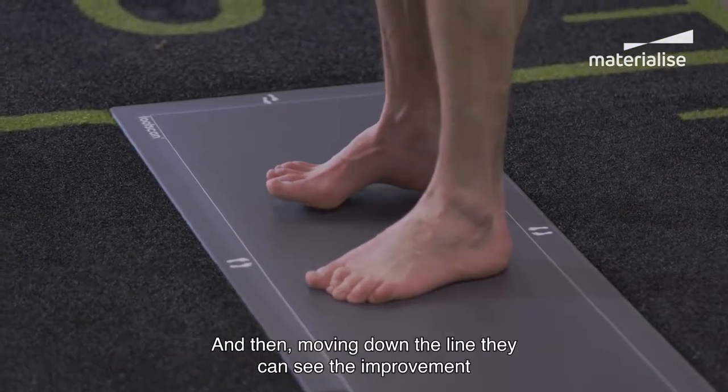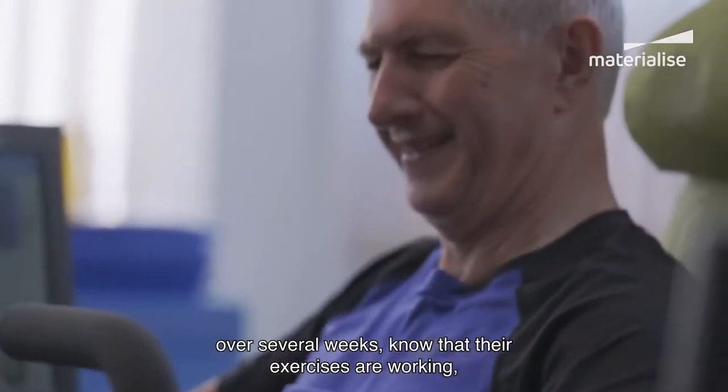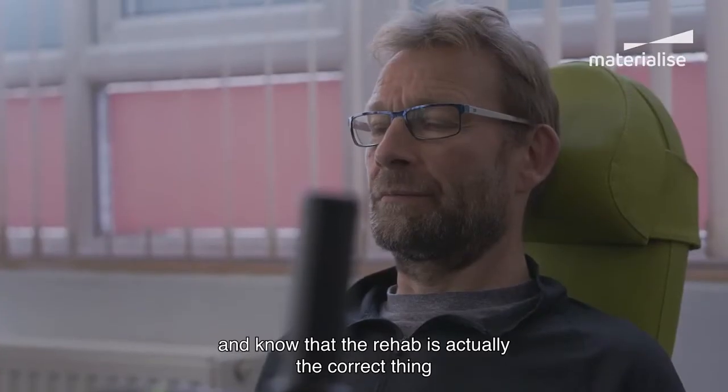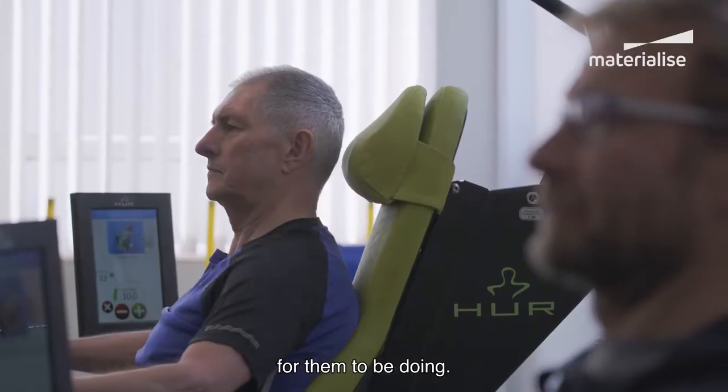Moving down the line, they can see the improvement over several weeks, know that their exercises are working, and know that the rehab is actually the correct thing for them to be doing.